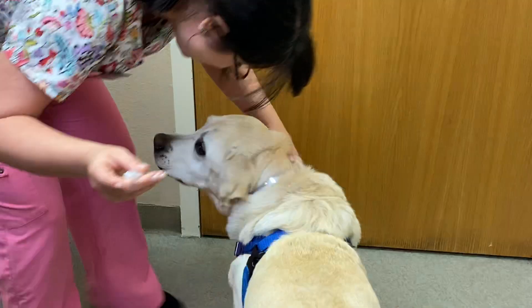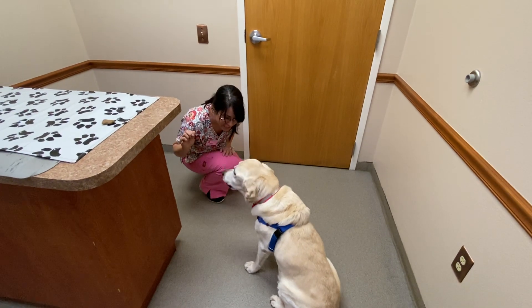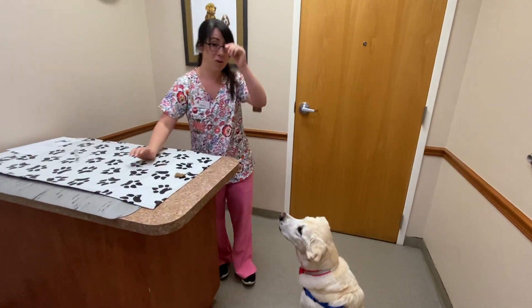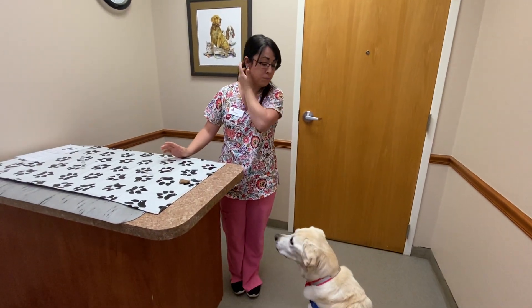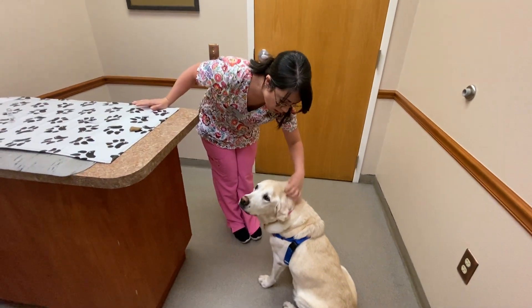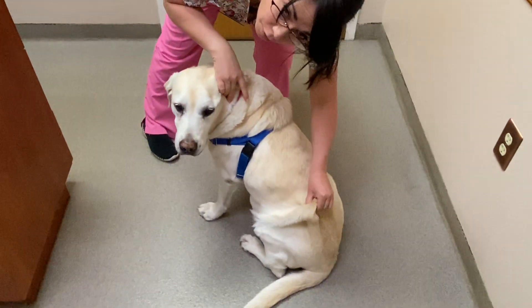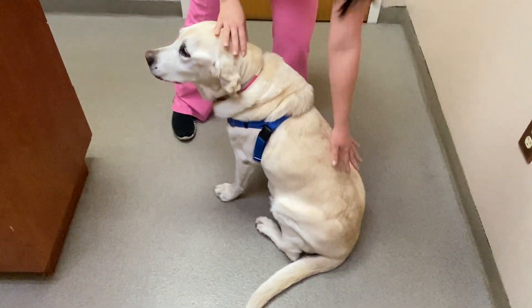Then push down on the liquid with nice even pressure, and reward lavishly — because Dakota is a good girl! When giving vaccine injections, you've got a lot of space to work with, so randomize where you give it. You can go up, to the left, or to the right. Some dogs even have extra skin back on their hips — these are all great places for subcutaneous injections. Randomizing prevents you from accidentally re-poking the same spot, which could start to hurt.